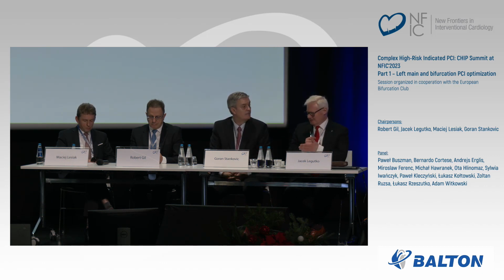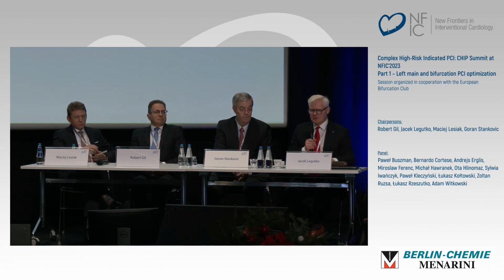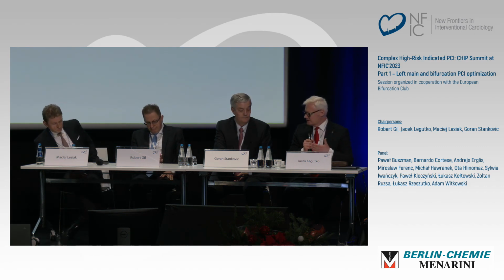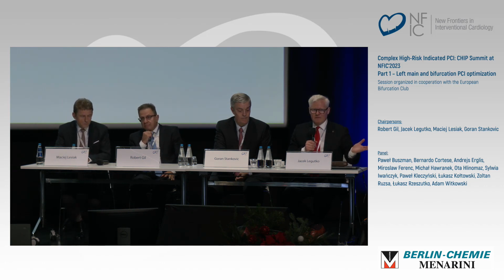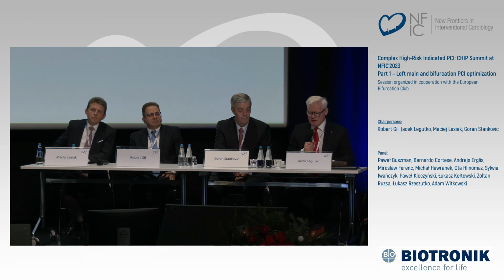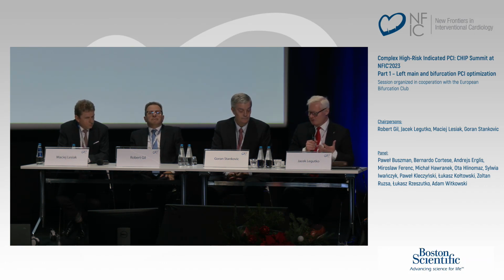This was a very good discussion at the end, that of course there are still some doubts, and we do not forget about two-stent strategy. However, we extensively discussed it last year. This year, we would like to remind you that the best strategy for the majority of patients is just single stent implantation. However, all of you who are interested can even test on the bench during this meeting how to do two-stent strategy appropriately. The problem is that you have to go step by step and know all the rules, and it is just much more difficult than provisional stenting strategy.